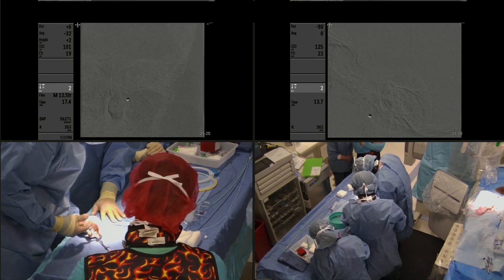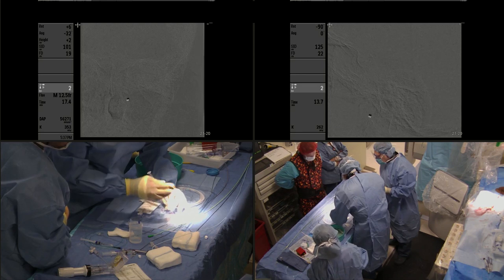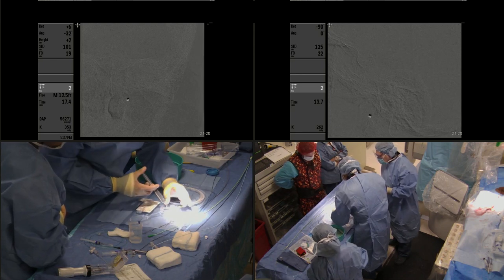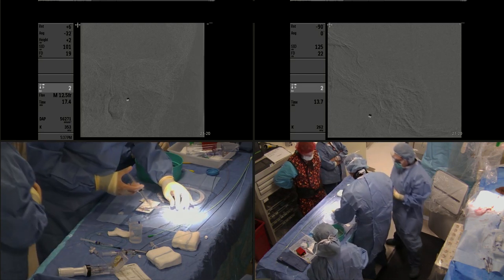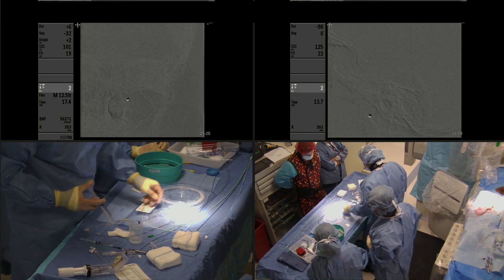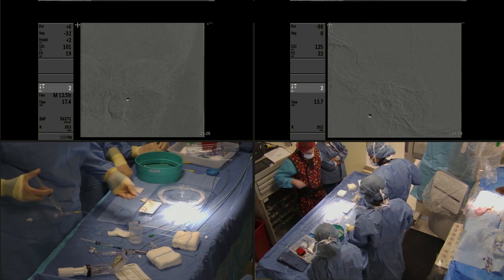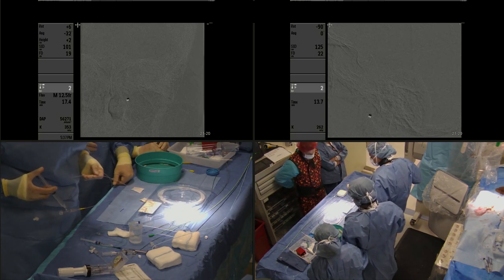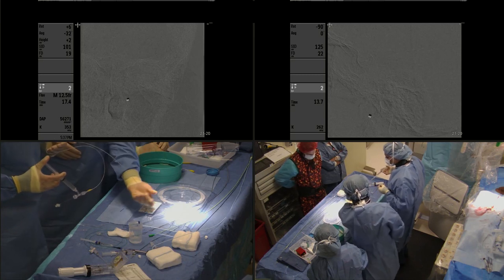You can see how we're preparing the stent after preparing the balloon microcatheter. For the stent we use a Wingspan 4 millimeters by 15 millimeters.